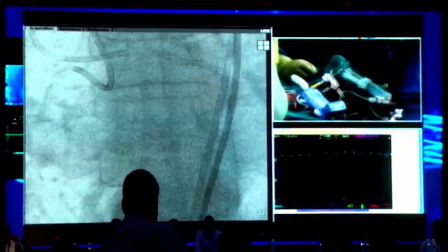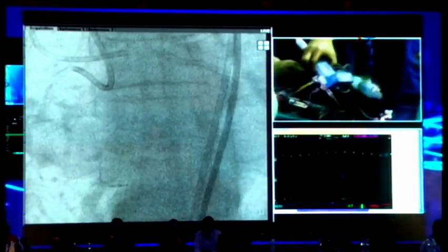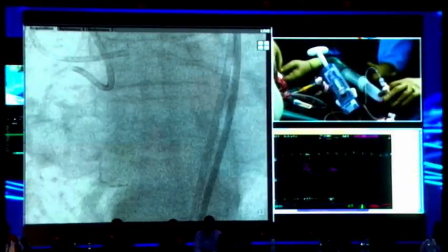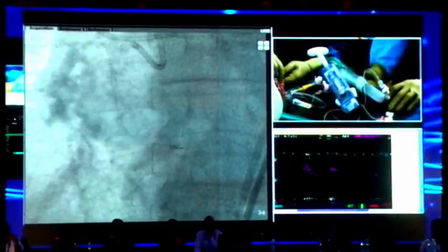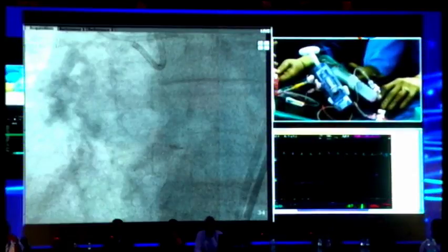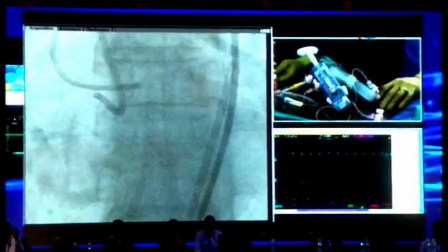What he is trying to do is a straw technique, aspirate the subintimal collection. Exactly. So we're reducing the subintimal space because it's dilated. Got it. So he's getting the hematoma out and then repuncturing, otherwise the space is too big. I'm just going to see if I can see anything at all. One port you inflated the balloon, the other port you aspirated. Move up. Yeah, that's it.